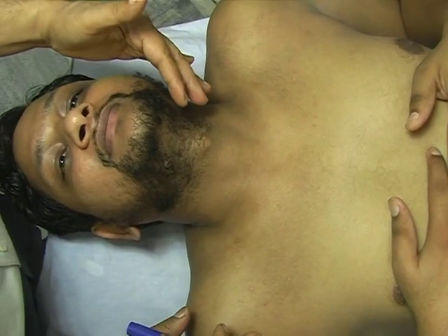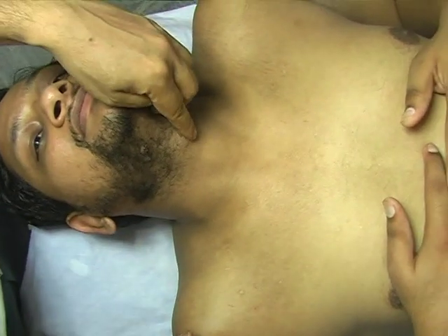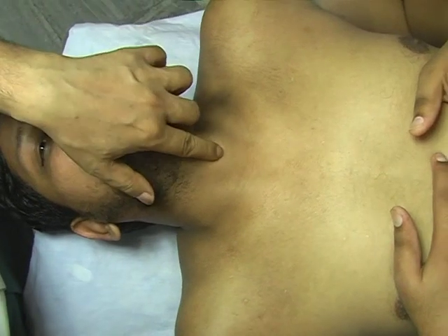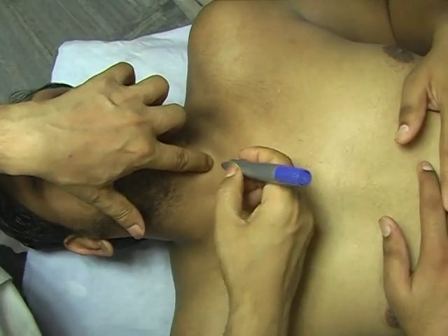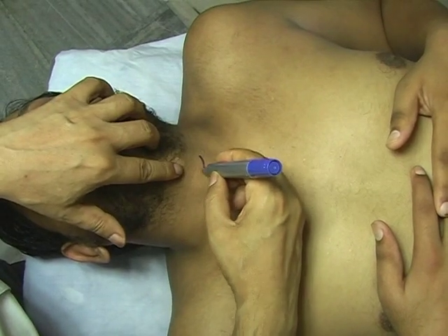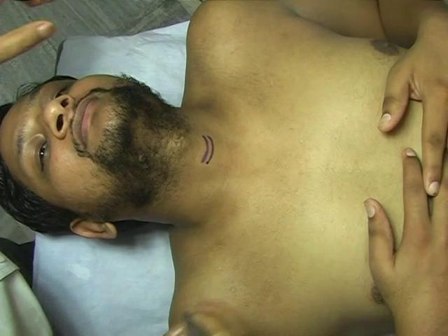For landmarks of the stellate ganglion: here you can see this is the Adam's apple, and just move your finger down — you can feel the first thick ring, that is the cricoid cartilage. I am marking it with the blue ink. This is the cricoid cartilage, and here are the upper and lower limits of the cricoid cartilage.